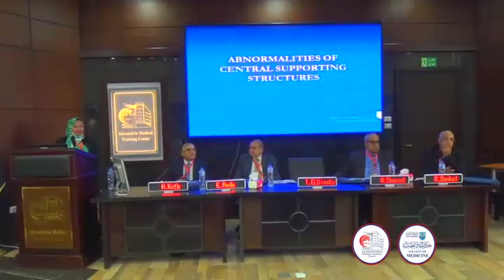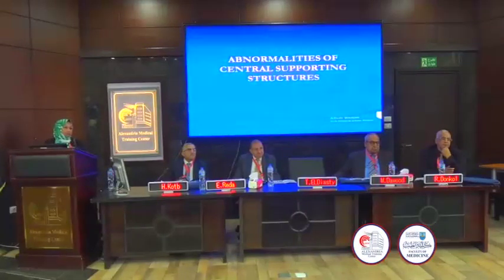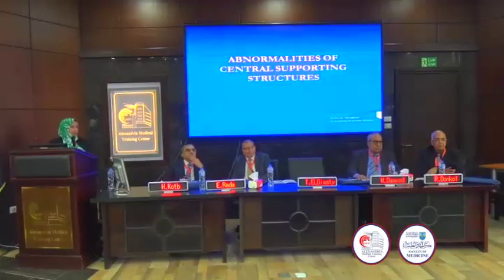For any side pain, whether posterior, medial, or lateral, we can start with ultrasound examination as a primary screening modality for the tendons and ligaments. As in Haglund syndrome, there may be Achilles bursitis and even a spur in the calcaneus. For the medial or lateral ankle tendons, ultrasound is very good.